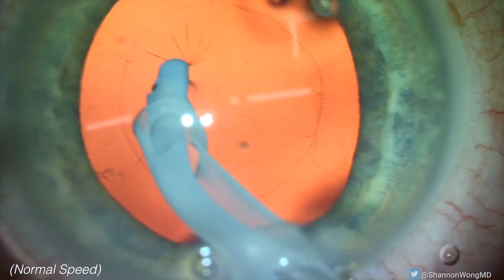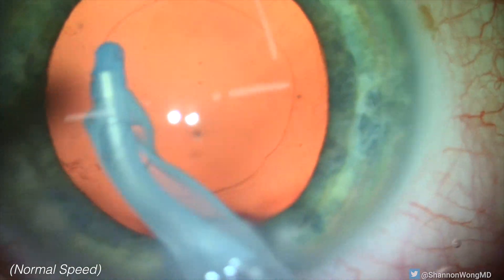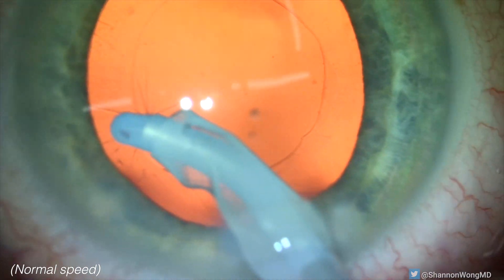Good — we're home free. Then we attempt to aspirate cells from the posterior surface of the anterior capsule and can see the aspiration port facing upward. Then suddenly, we see stellate folds in the posterior capsule.